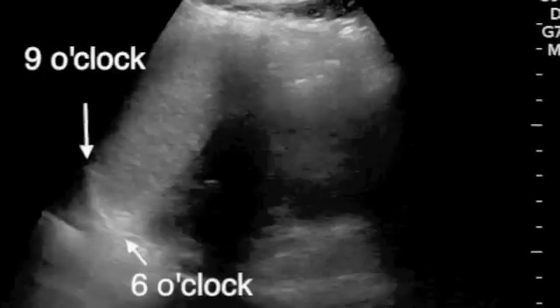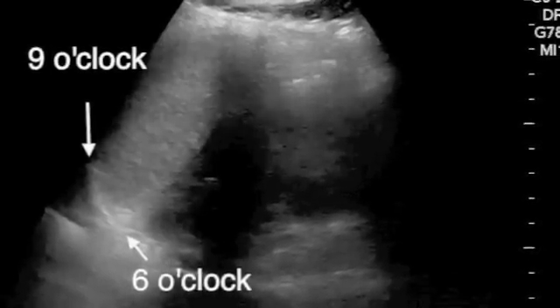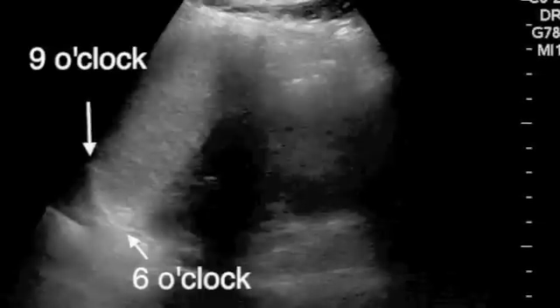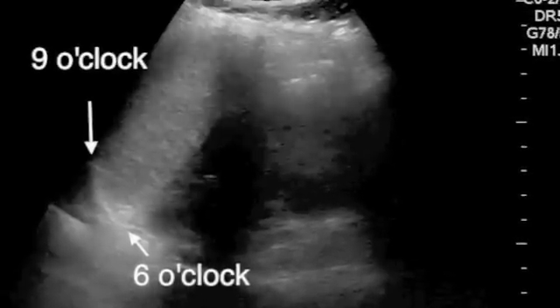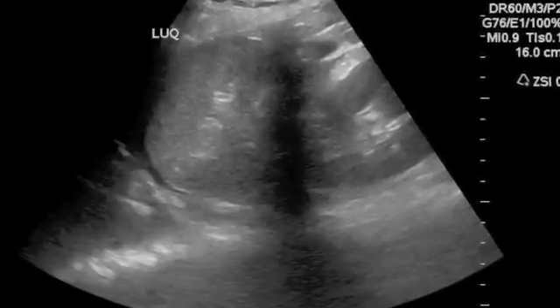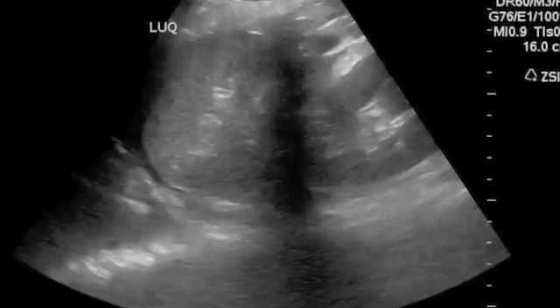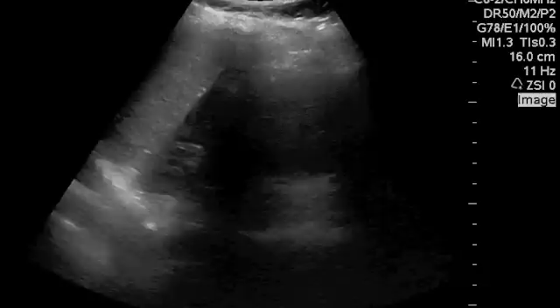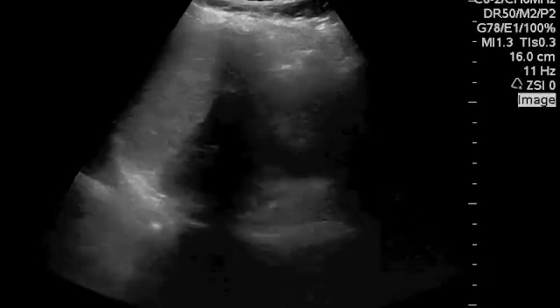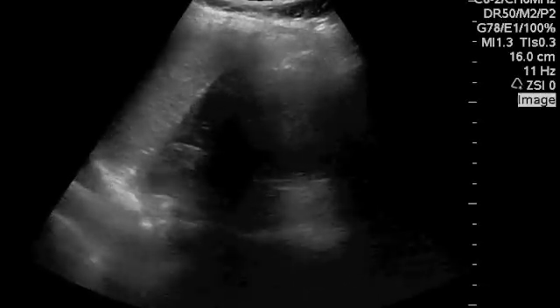In the left upper quadrant, it's really important to see the diaphragm from 6 o'clock to 9 o'clock. As you can see in this picture, you often only see the fluid underneath the diaphragm. You'll notice that as the patient breathes, the diaphragm moves in and out of view — you have to be patient.